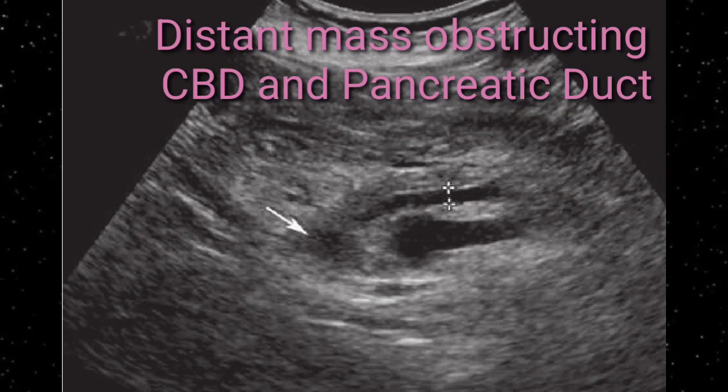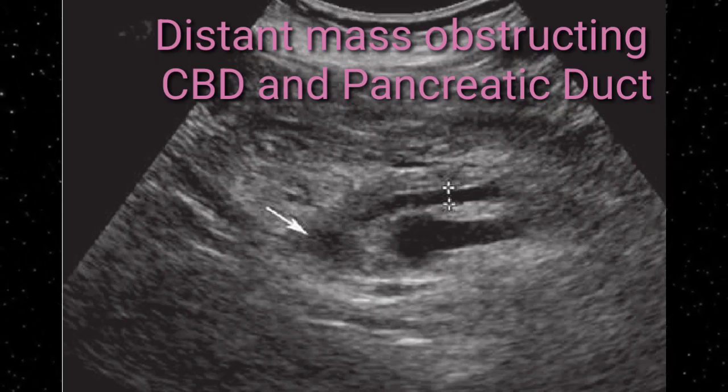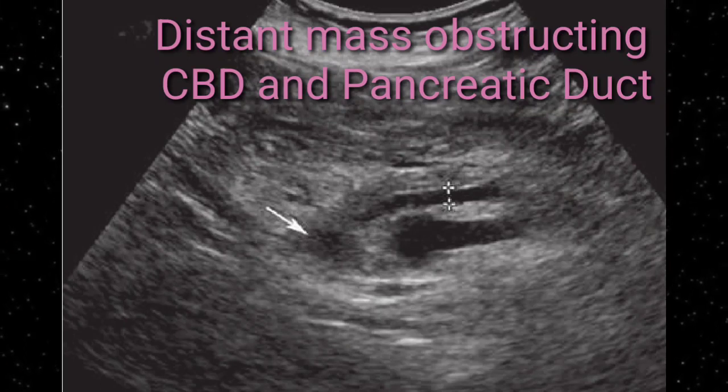Carefully look at the head region and try to appreciate any subtle findings or any changes in the echogenicity of the head of the pancreas.